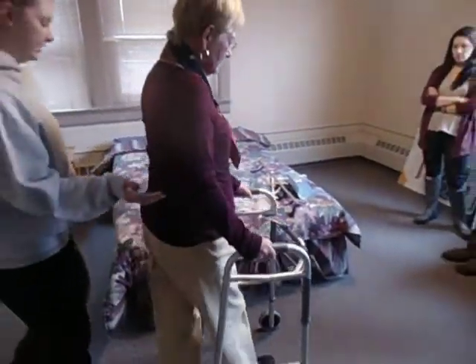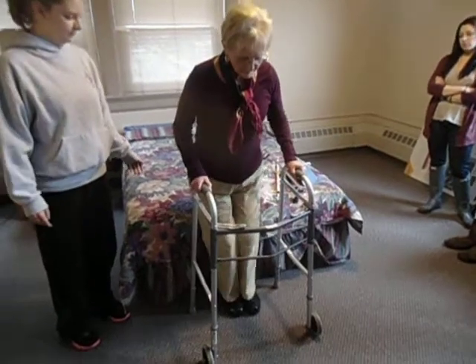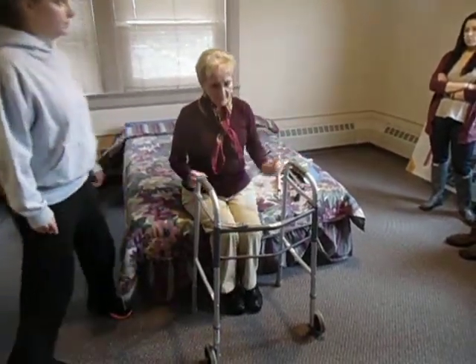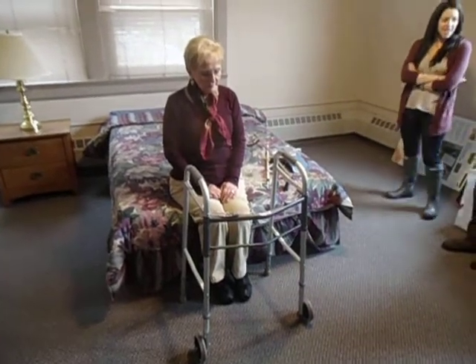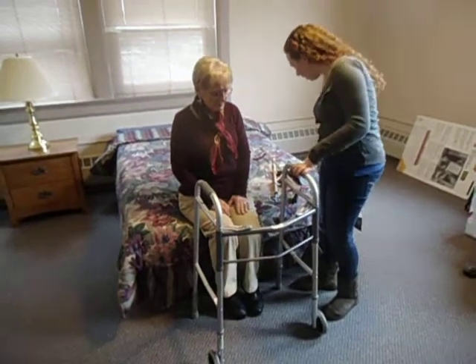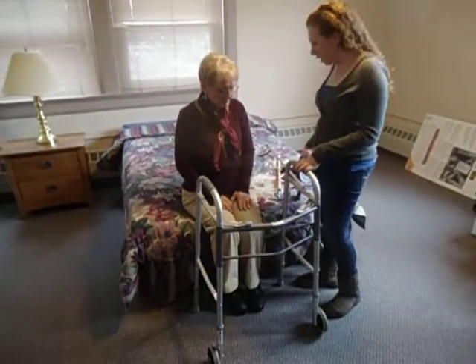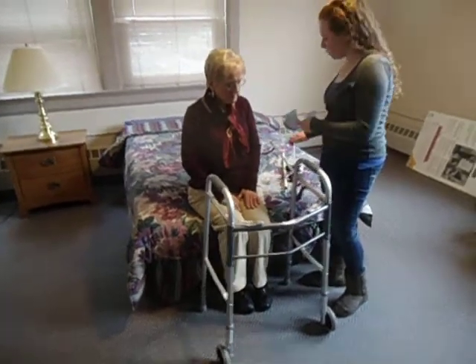Mrs. Jones, why don't you have a seat on the edge of the bed? Good job. Thank you. Hi, Mrs. Jones. I'll be your occupational therapist today. I'm gonna show you a few pieces of adaptive equipment that you can use to adhere to the hip precautions.